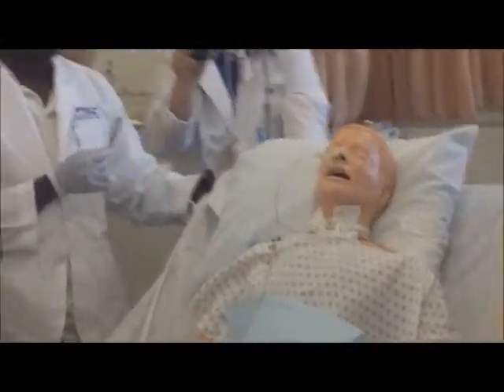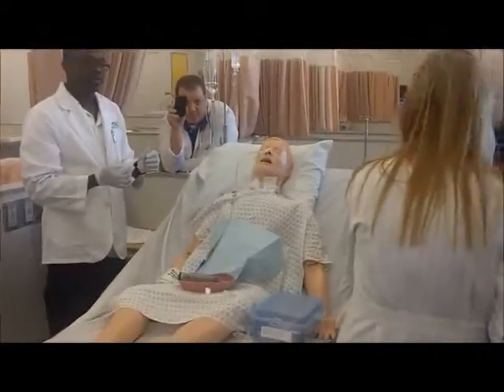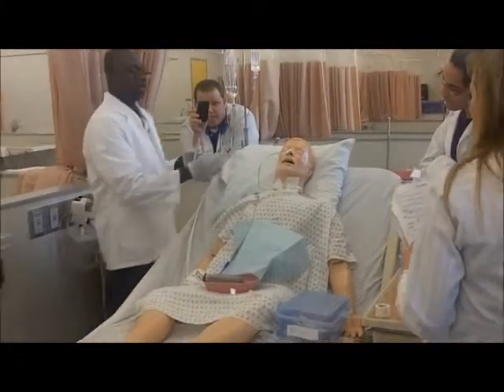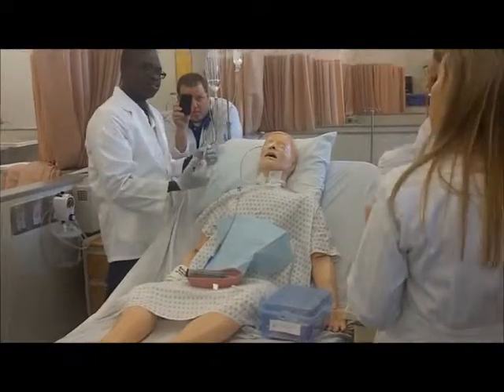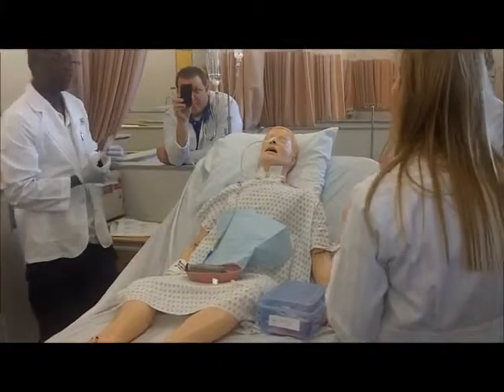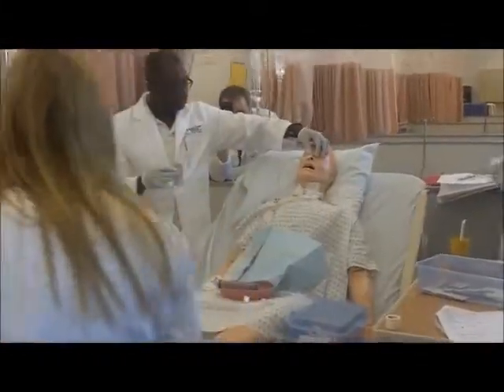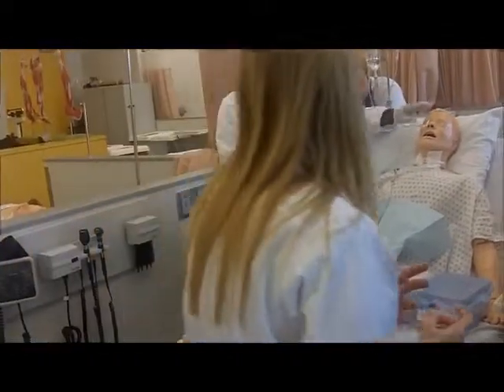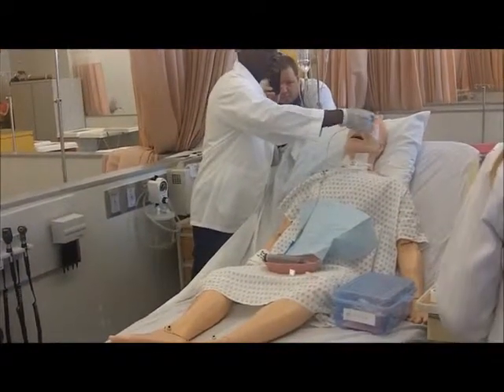Okay, so what else do you need to do? Are we done yet? Yes, or auscultate? Oh, you did that. Okay. Is the patient comfortable? You know, the tube will be sticking out like this, rigid like this. Yeah, it may be sticking out just like that. That's why I want that benzoin to stick. You want to really let it dry good. It's supposed to be in the middle. What else do we need to do?